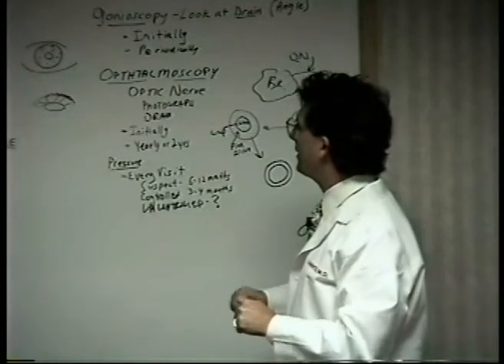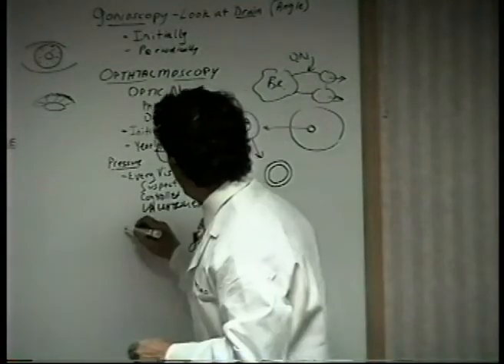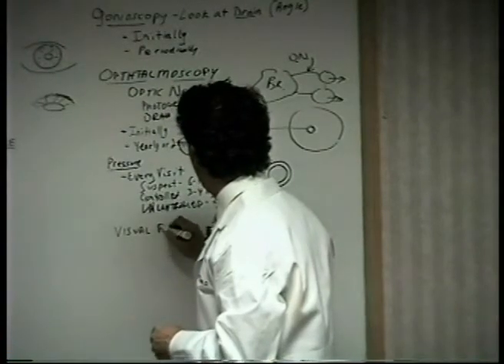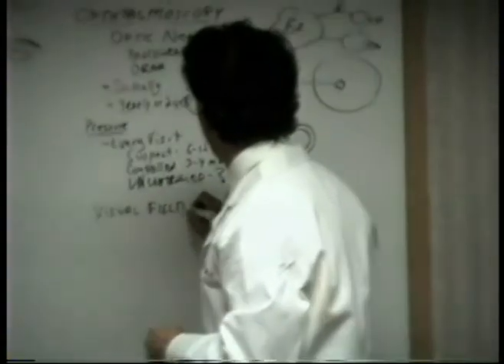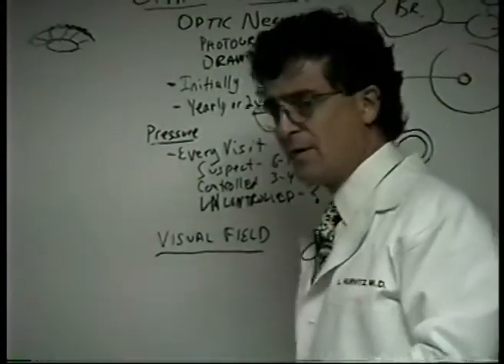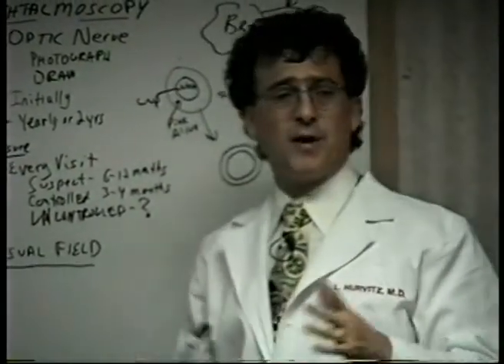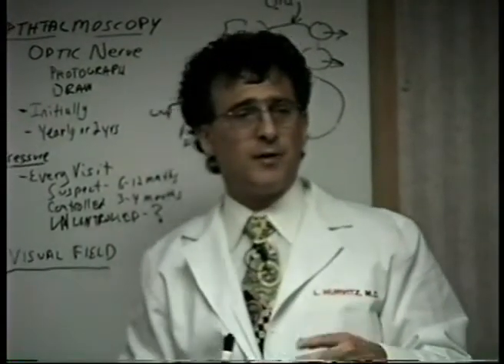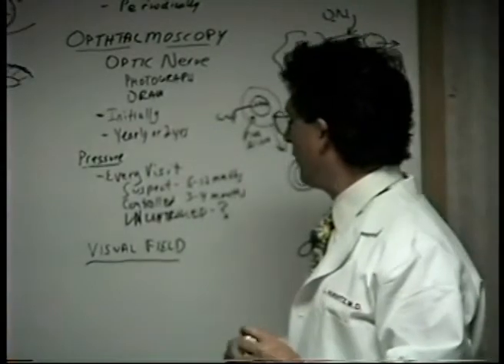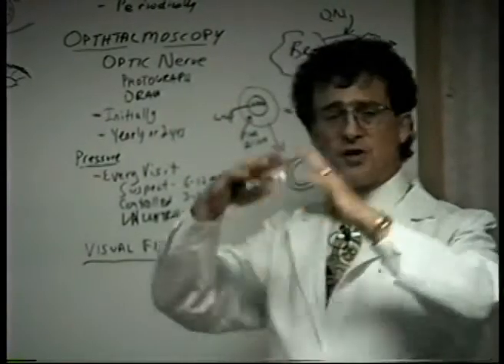Okay. So somebody mentioned visual field. That's the other big piece of this puzzle that I want you to know about. Visual field. Now, what is the visual field? Anybody, how many of you have had a visual field test? Probably a lot of you have had it, right? Yeah. Unfortunately, right? It's a long test. The visual field is your side vision.